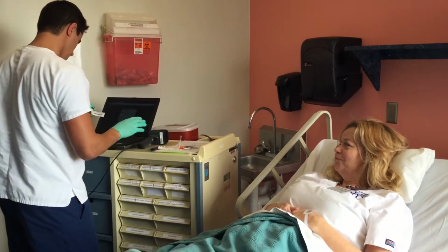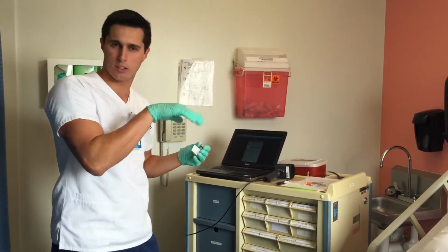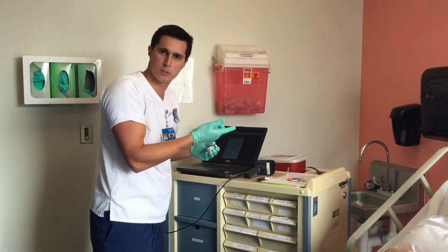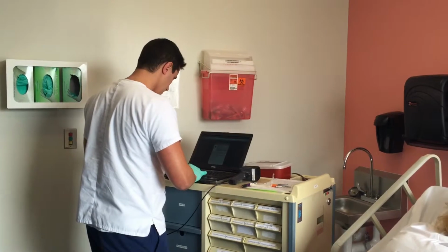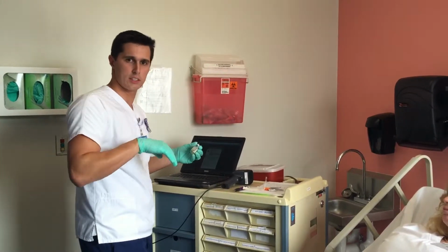What we're going to do is I made sure that the patient is right, and the name and the birthday are right. The medication is right and it's the right time. We already drew it, 16 units. It's the right dose. And I'm not going to sign it until we have completed the administration.